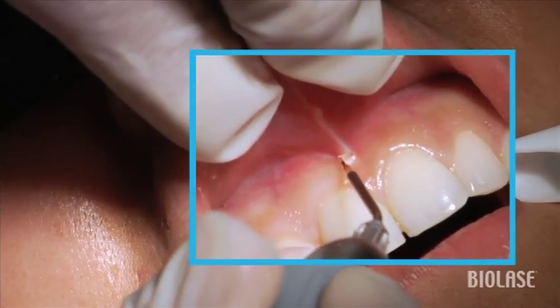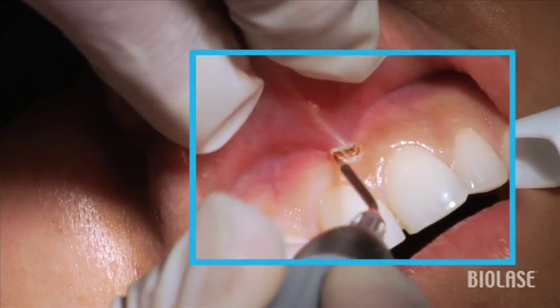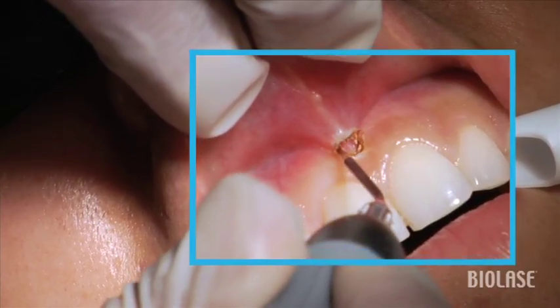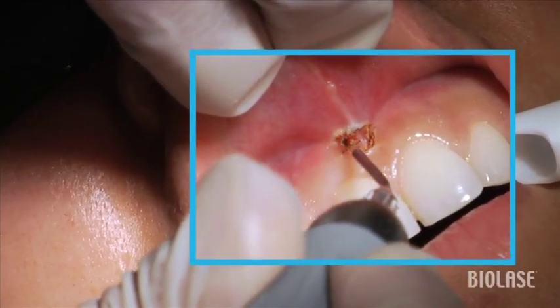We can do this either with a strong topical anesthetic, or for your first several cases probably a local anesthetic, but only use a few drops of local anesthetic, because if you use even as much as a quarter of a carpule, you'll end up distending the tissue and not being able to see the extents of the muscle attachment.